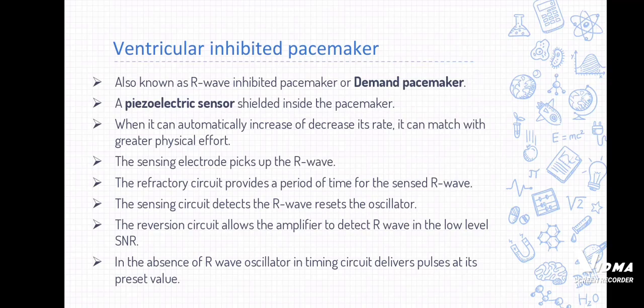Ventricular inhibited pacemaker. This pacemaker is known as the demand pacemaker. The comparator determines the pacing rate of the pulse generator. The output is given to the second RC network. The pulse width circuit determines the duration of the stimulating pulses. The rate limiting circuit disables the comparator for a short time interval and limits the pacing rate. The output circuit provides a voltage pulse to stimulate the heart.